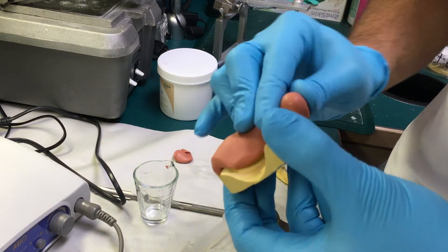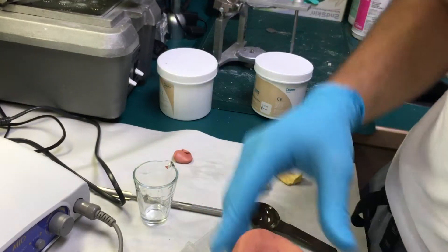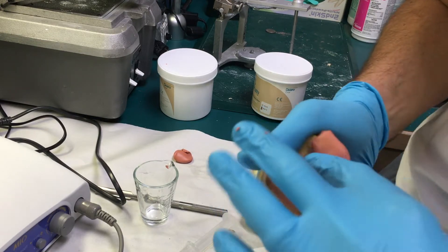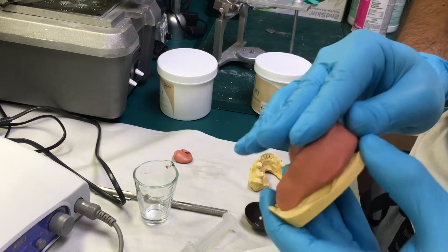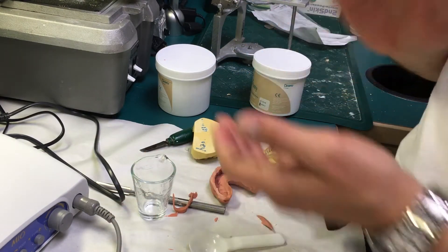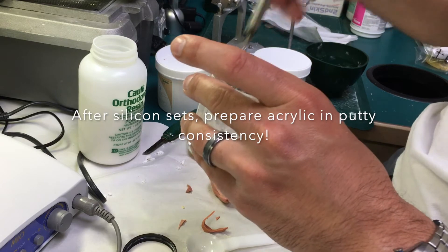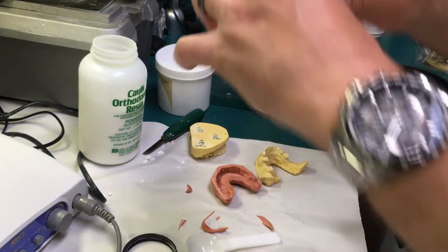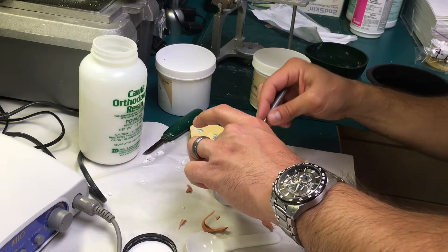You're basically making an impression of this cast. You want to make sure that it's thick enough in all areas so it doesn't prevent you from using it, and you're able to remove it without any tearing. Now it's time to mix our acrylic. I want you to see this consistency — it's very putty-like.